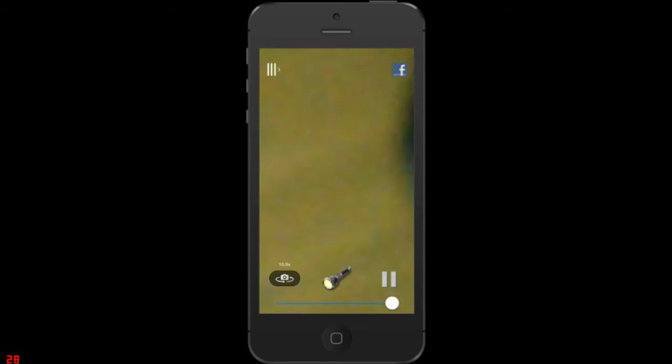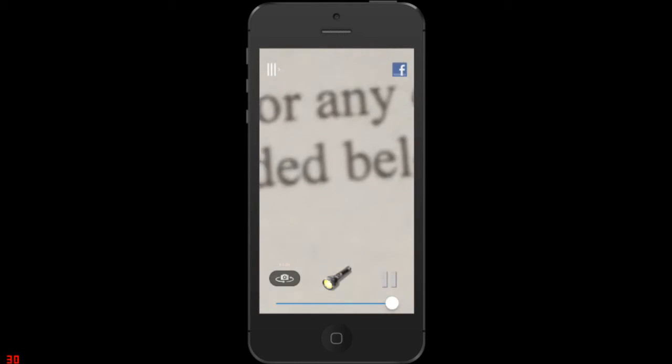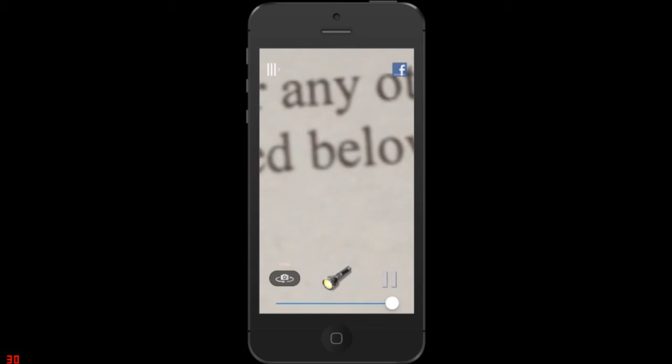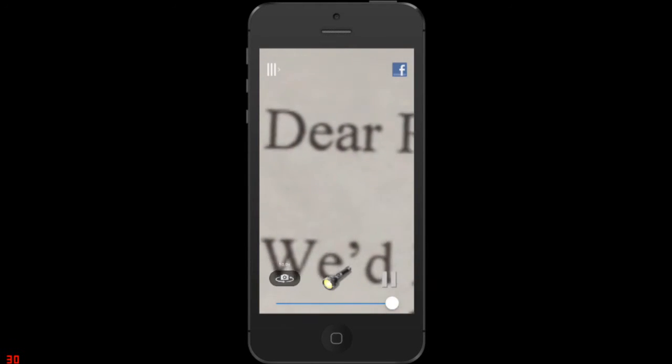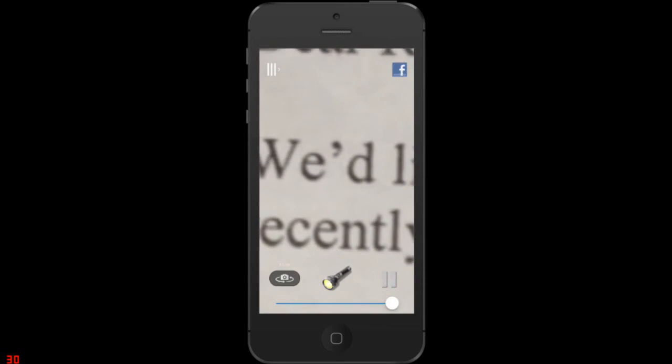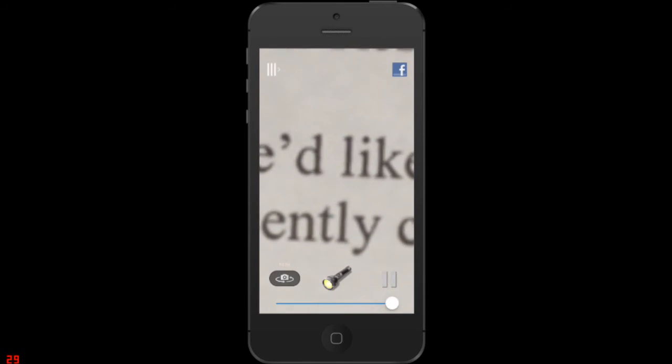Now on the bottom, I'm going to hit the flash button there. I have a flash button, a camera button, and a pause button, which will freeze it. Okay, sweetness, that does actually work. Now, keep in mind, I would normally also be doing this in landscape, but just for the purposes of showing you this, I'm going to use it in portrait just so I don't have to worry about screwing up the recording. So I'm holding it a good 6 inches away from my screen right now. I am in very low lighting.